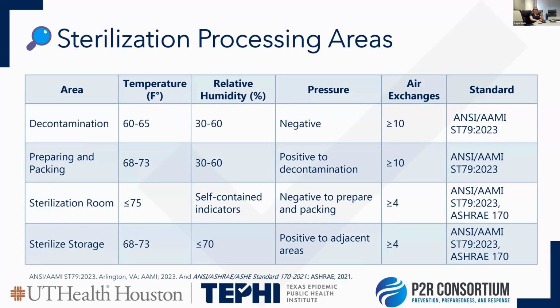Then you have the next room, which is your sterilization, with its own temperature and humidity. It should be negative relative to the packing area, with its own level of exchanges. And then you have your sterile storage, where the equipment is stored after it has been run through.